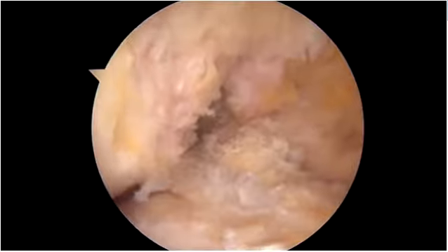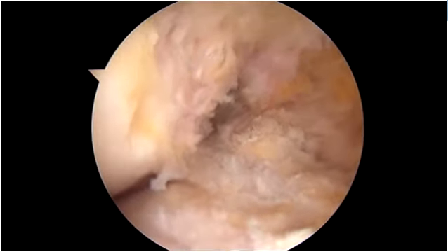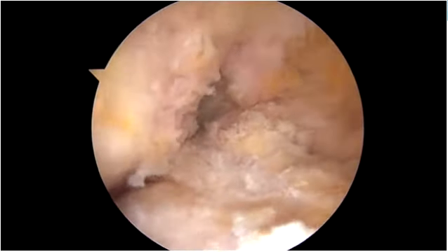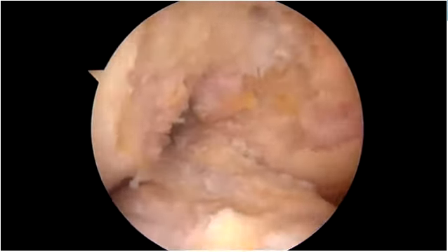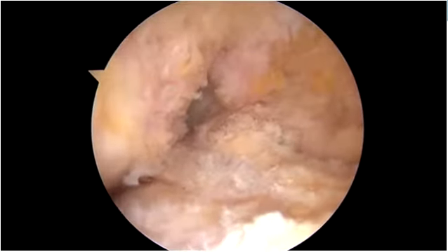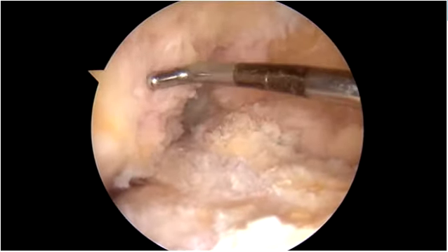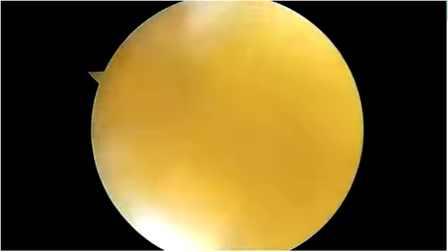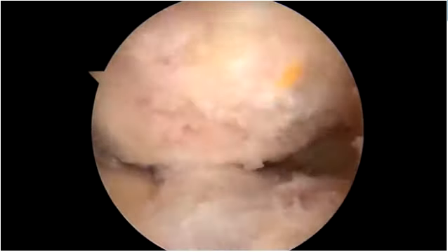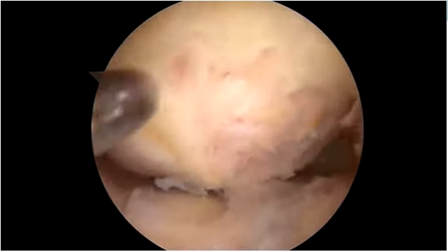Yes, looks perfect. This knee had a lot of osteoarthritis, big notch osteophyte, so we had to do a notchplasty to find the ACL. This is the view from the lateral portal, your classic lateral portal view. And the ACL is somewhere down here. The ridge is somewhere down here. But you get a much better view, and I think this is really important, if you switch to the medial portal, and you can see the ACL very clearly.